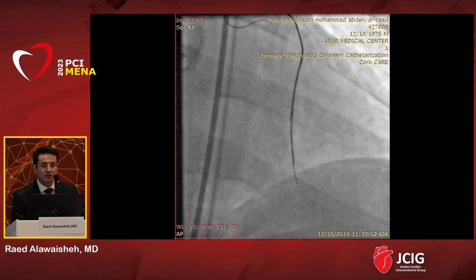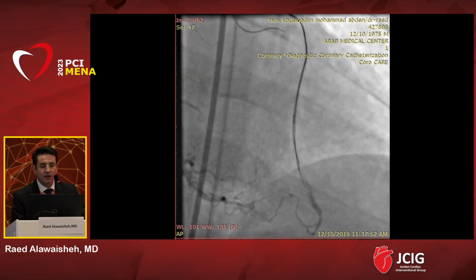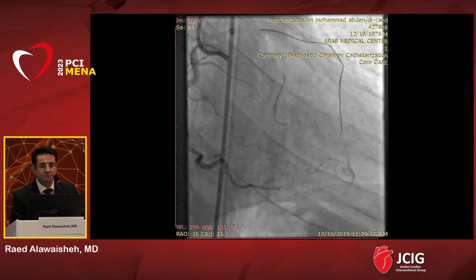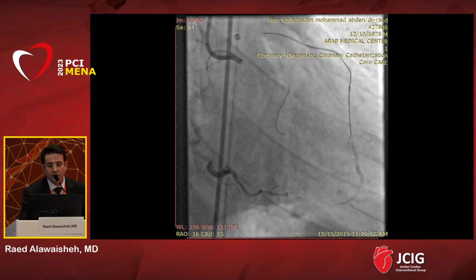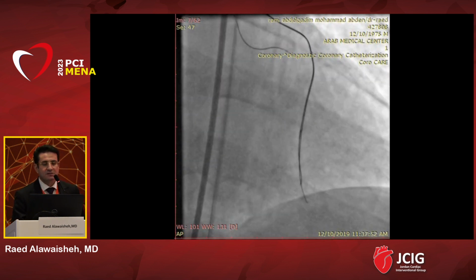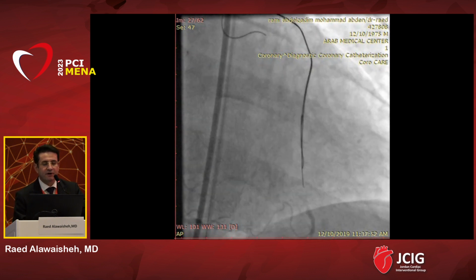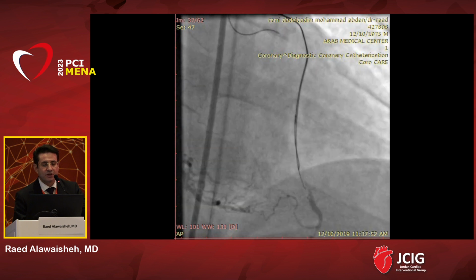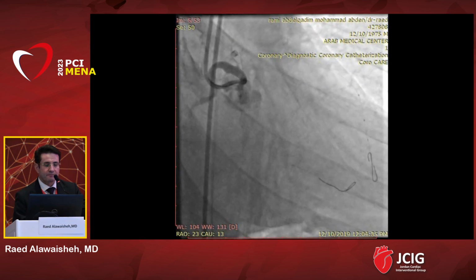And unfortunately, I don't have Stingray in that cath lab that day. So I stopped there, and not to lose what I did and lose half the job, at least for the ambiguity of the LAD, I implanted a stent. When I returned after 1 month, I found that the hematoma had resolved distally and it was easy to go from the proximal part, from the ostium of the LAD. And this is what happened.